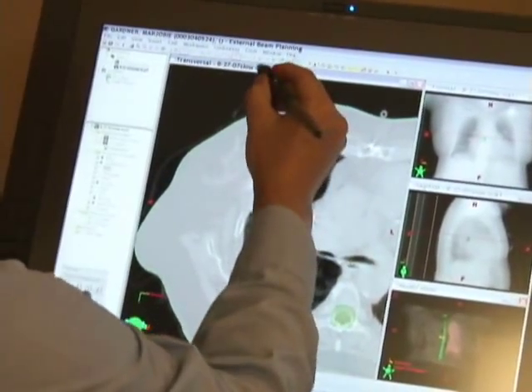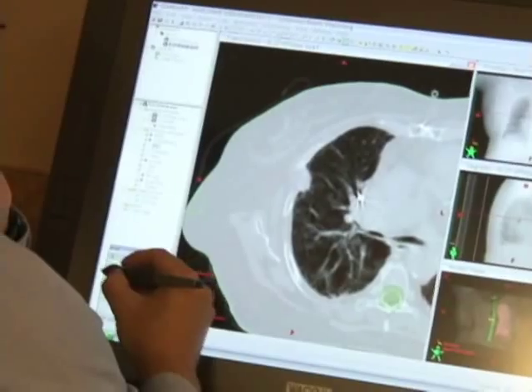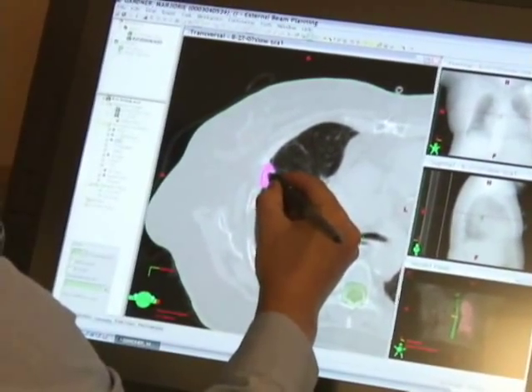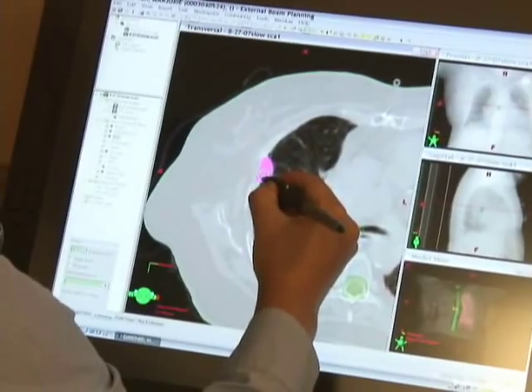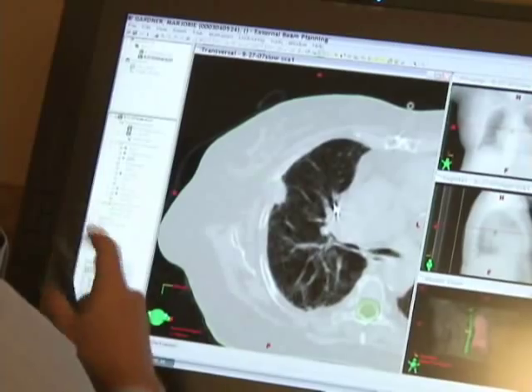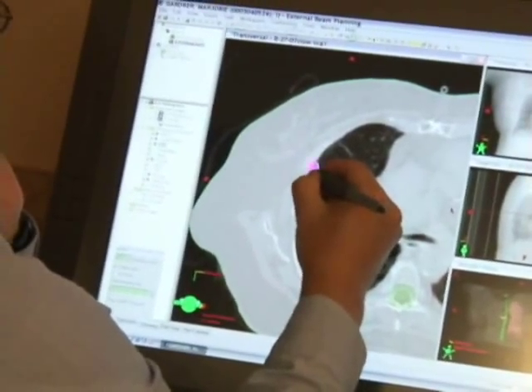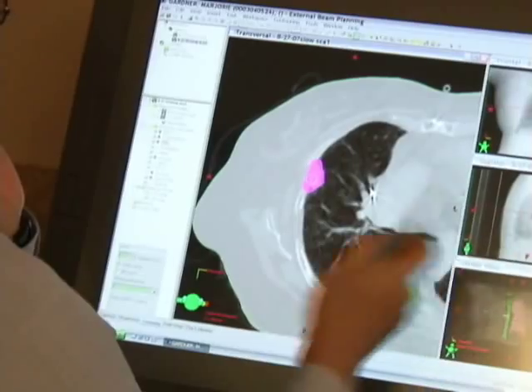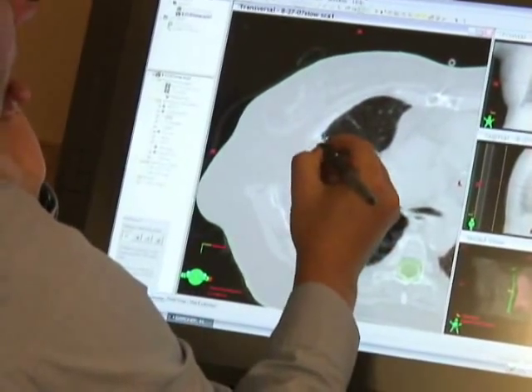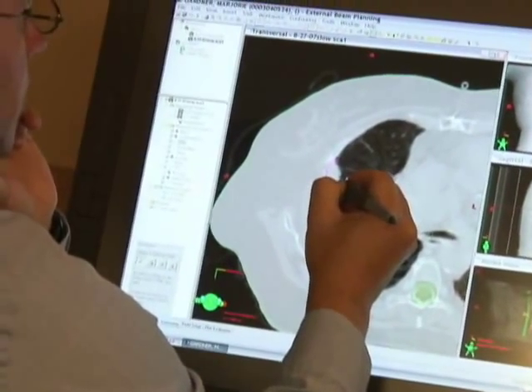We have a few tools available. We have the paint brush here, and the paint brush tends to conform based on Hounsfield units — you can turn that on or off, and you can erase what you're doing. We also have a static brush if we want. I typically like to draw like this.